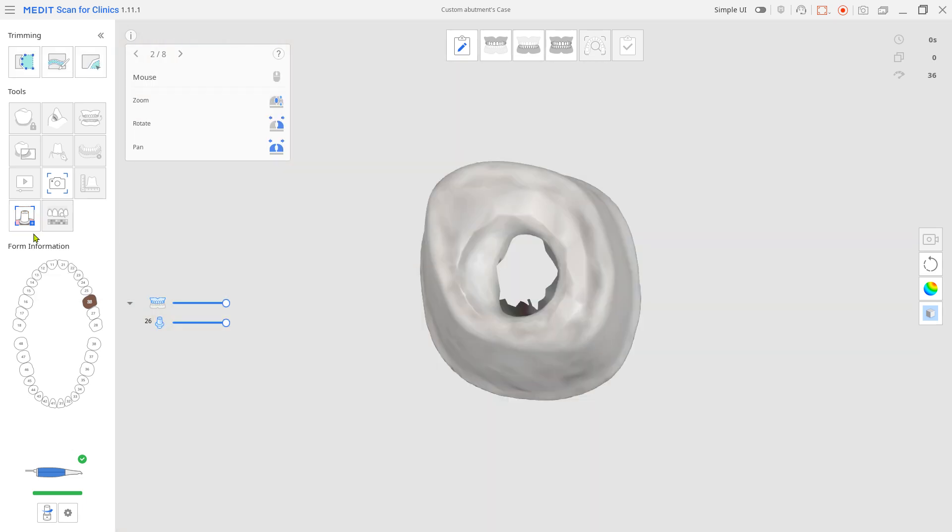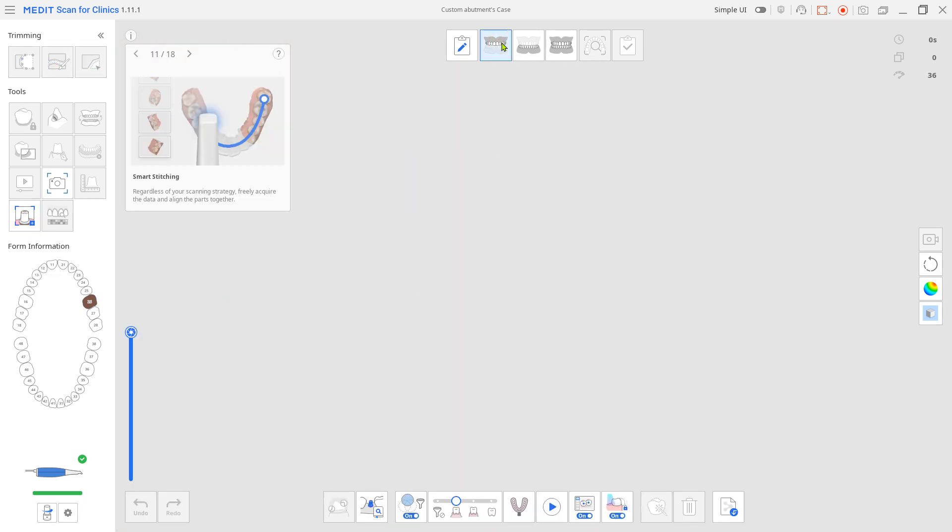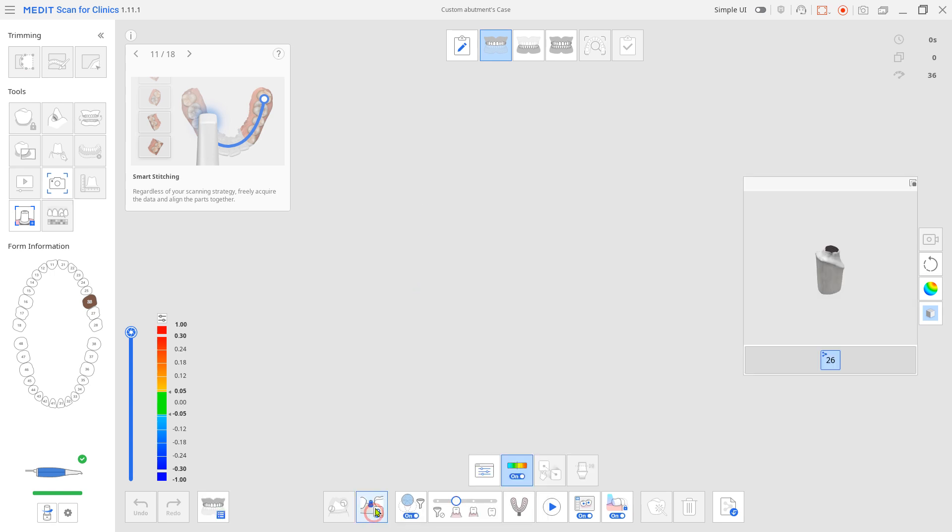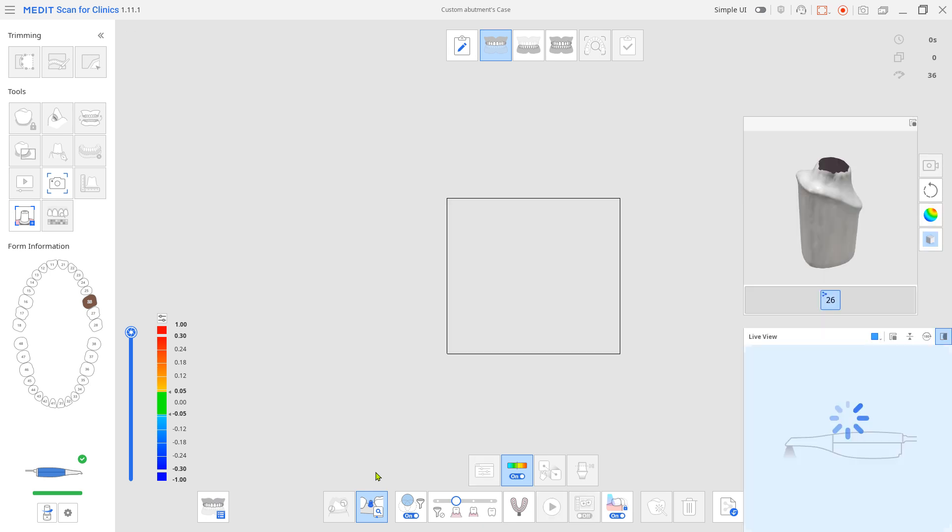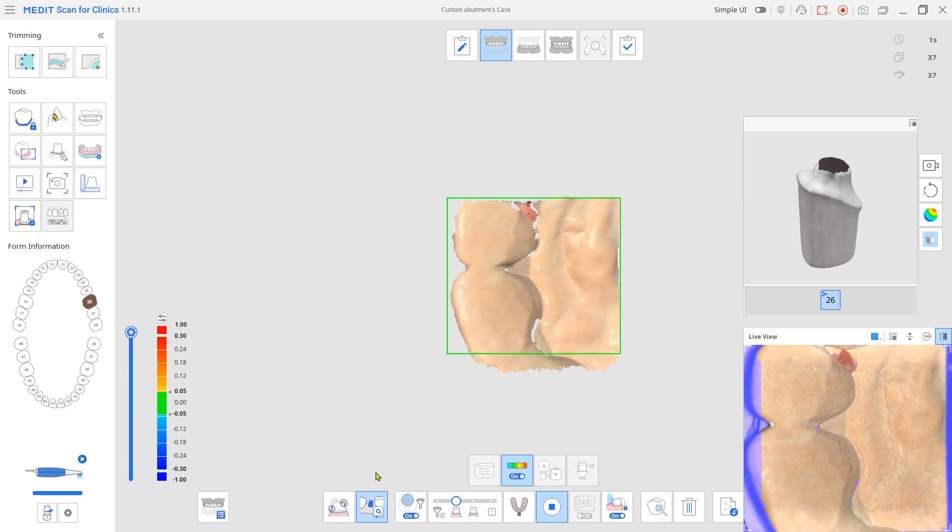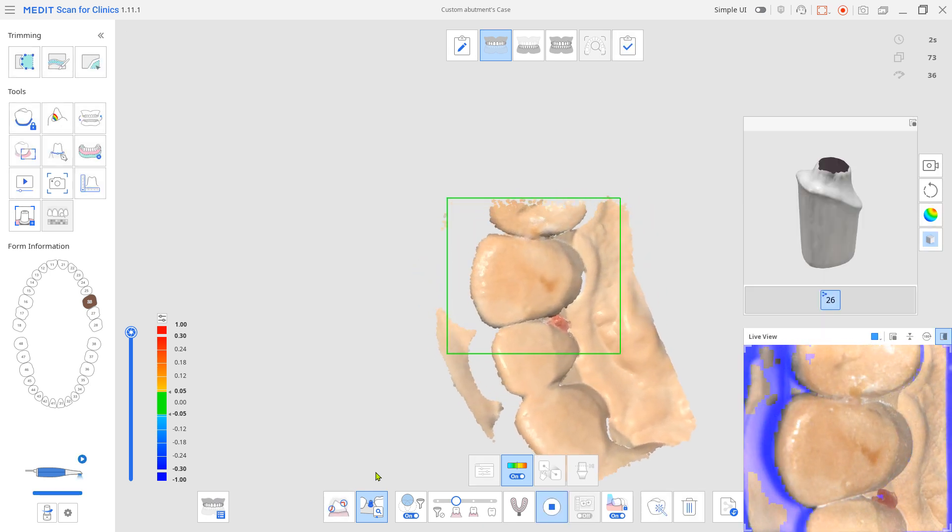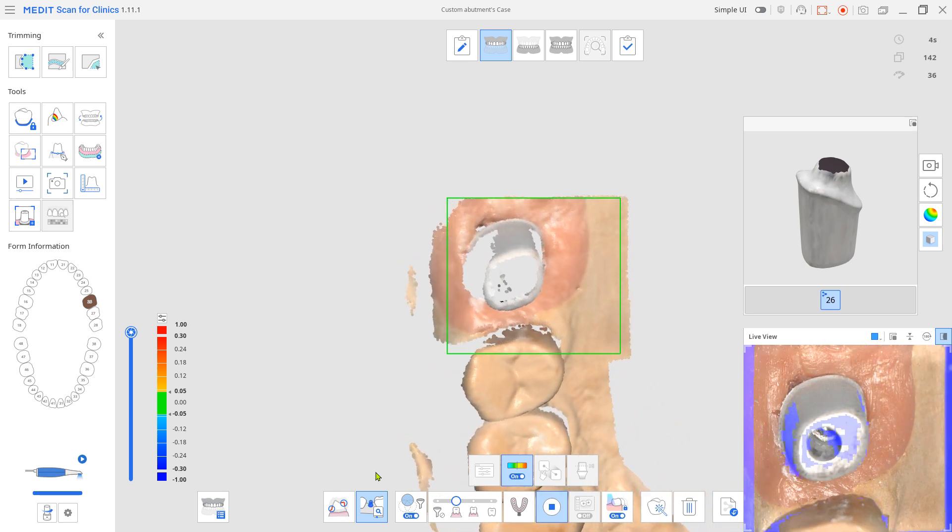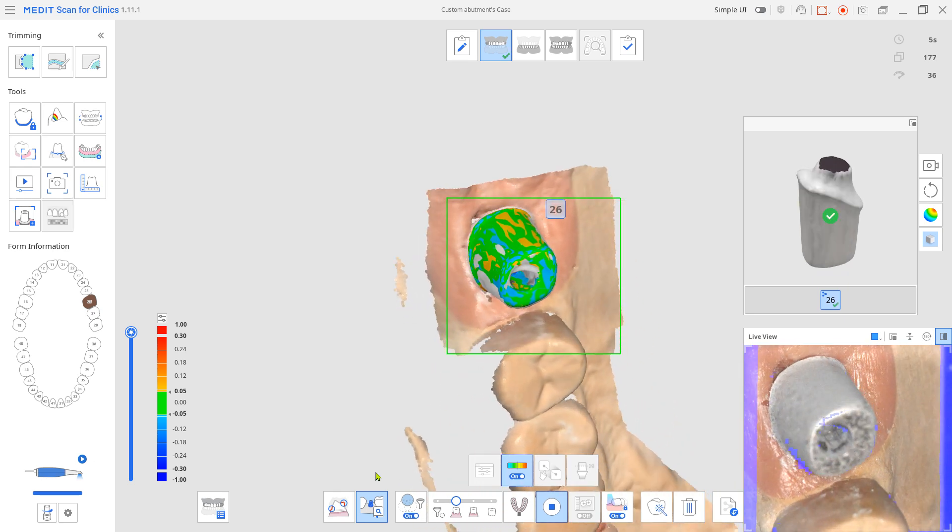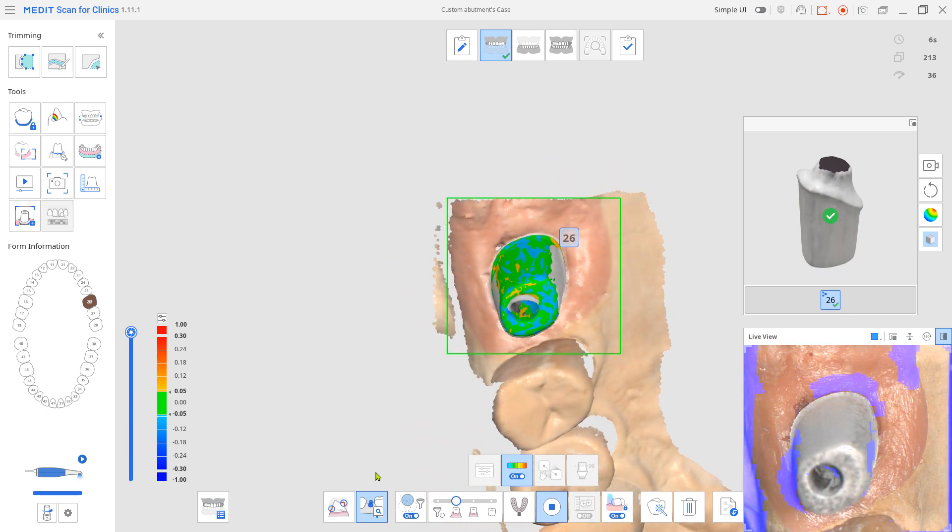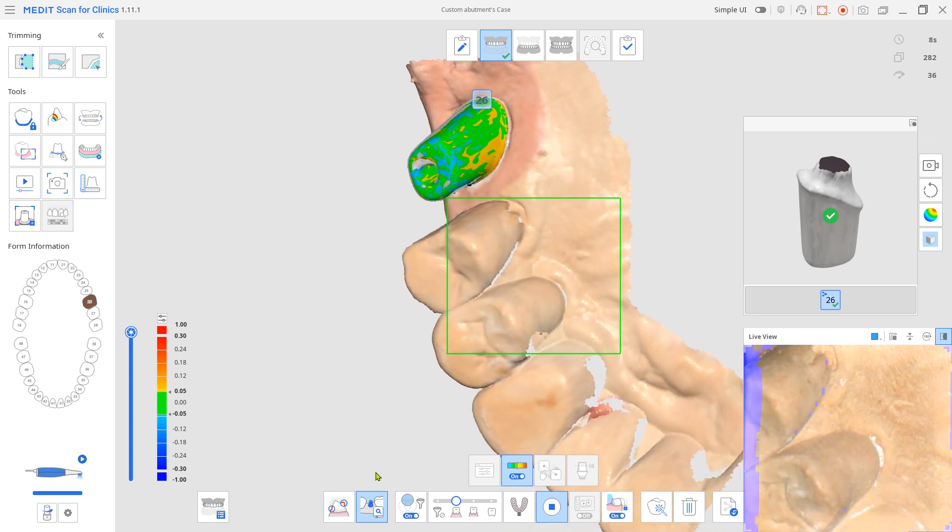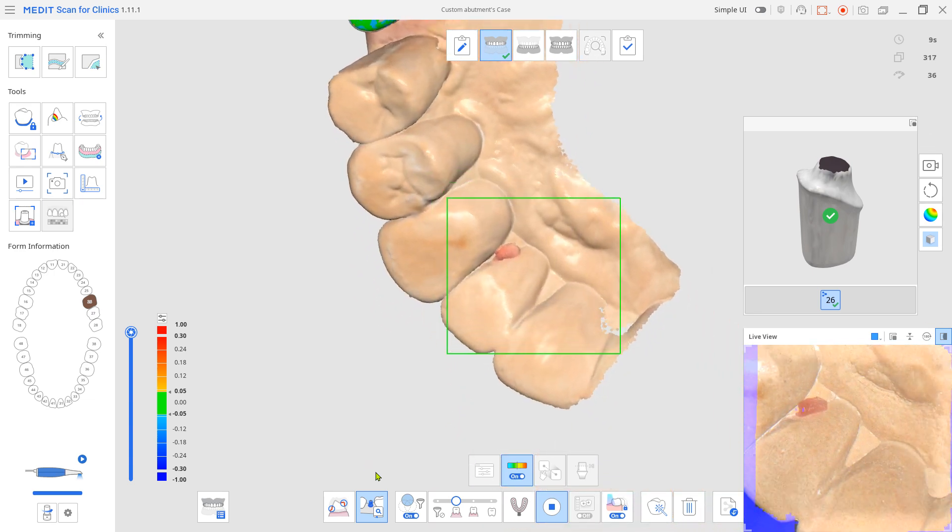Go to the maxilla scan. Choose AI abutment matching from the bottom. Place the abutment in and scan the implanted arch. In just a few seconds, the system will automatically align and overlap the registered abutment to your scan data.